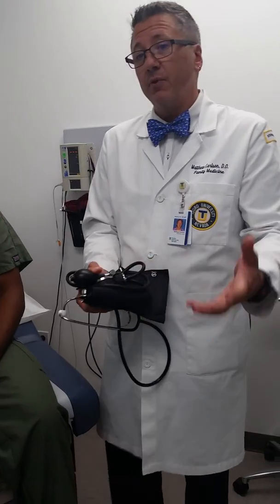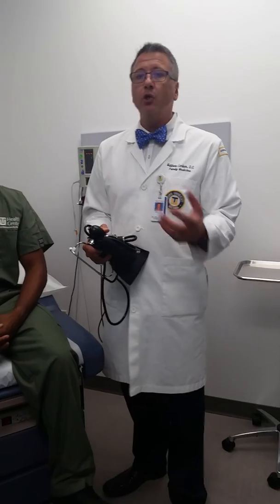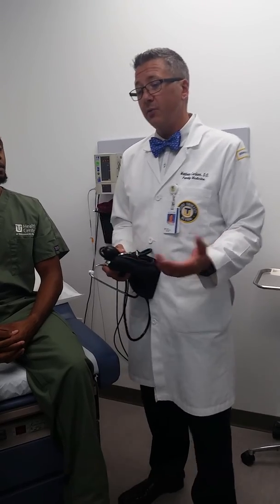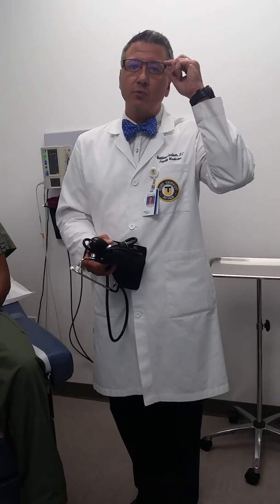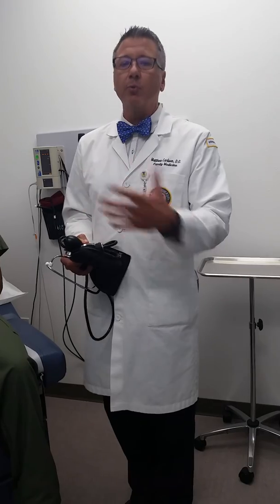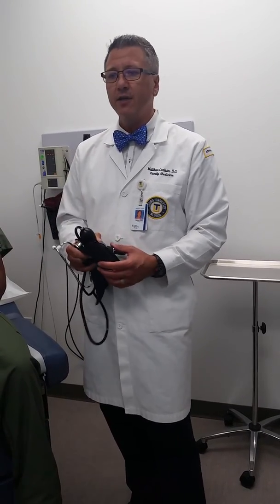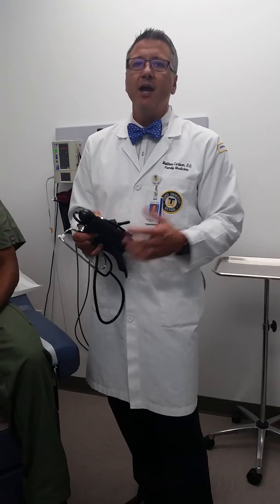You can tell your patient their numbers, and if the numbers are irregular or abnormal you can reassess in 10 to 15 minutes to confirm a true reading. If a patient consistently has elevated blood pressures, another tool is ambulatory blood pressure monitoring — where the patient uses a wrist or arm blood pressure cuff at home, records their numbers over a period of time, and brings those numbers into you so you can see what their blood pressures are like in the real world.